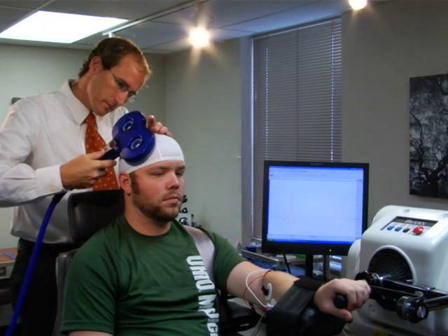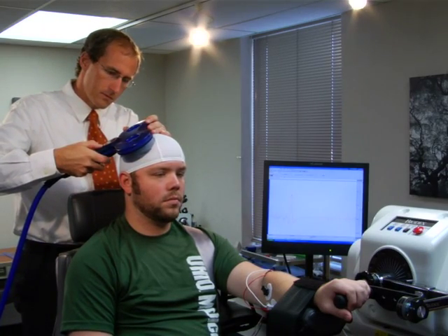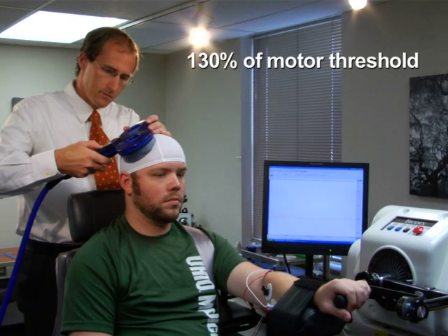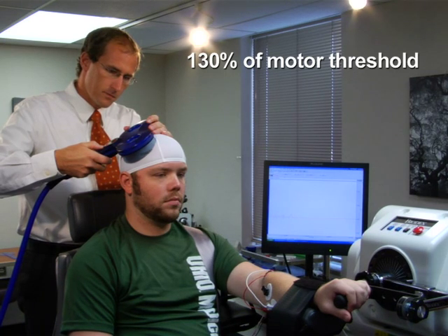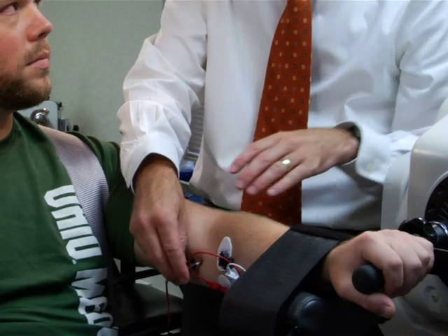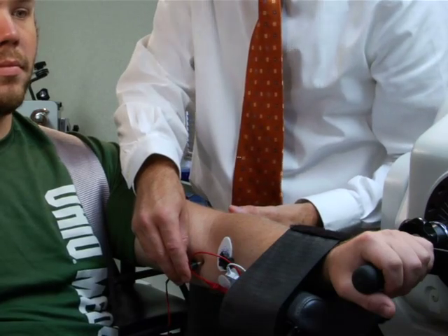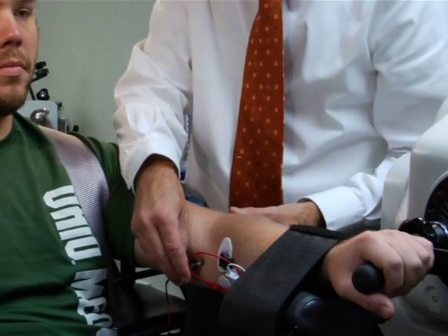To examine the motor evoked potential amplitude of the FCR, deliver a single TMS pulse to the previously determined hotspot at an intensity equal to 130% of motor threshold and calculate the peak-to-peak amplitude. This outcome can be normalised to the maximal compound muscle fibre action potential observed following supramaximal electrical stimulation of the median nerve. When a TMS pulse to the cortex is delivered during muscle contraction, it will produce a motor evoked potential followed by electrical quiescence before activity resumes, indicative of corticospinal inhibition. This is commonly referred to as the silent period.